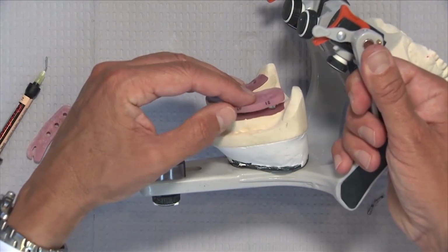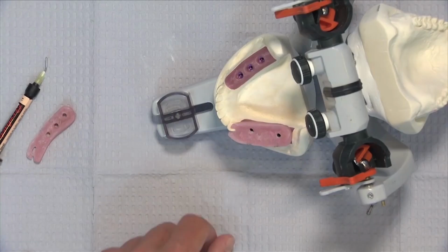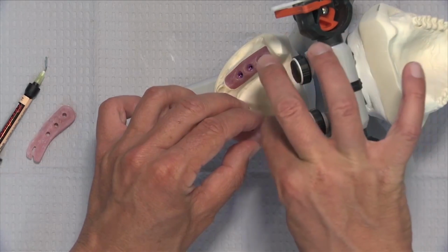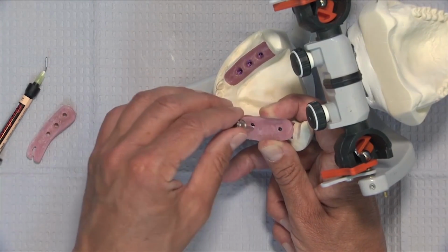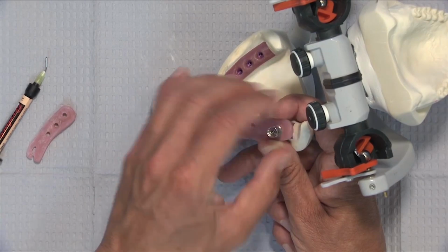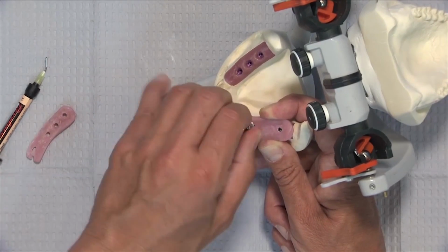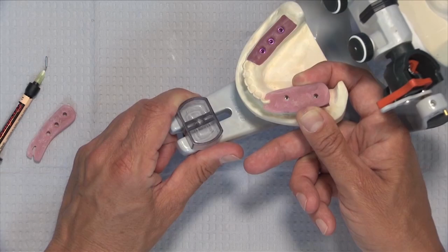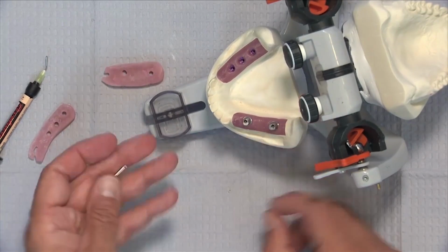So now we'll take the index, and not only should the two custom abutments fit into the soft tissue spots, but you can see when viewed from the occlusal that it also has an index on the adjacent natural tooth. So at this point, we'll drop the 2 screws into the custom abutments and then begin to tighten the screws down. And I can feel the distal part of the positioning index seating as the screws tighten down as it falls into place. Again, with the custom abutments being held so that they really can't rotate. Just going back and forth and making sure that they are tight. And then I verify occlusally that we're in good solid contact with the cuspid in this case. So at this point I can take my little index off and just flick off the two little pieces of flowable composite that kept it from falling out of the splint.